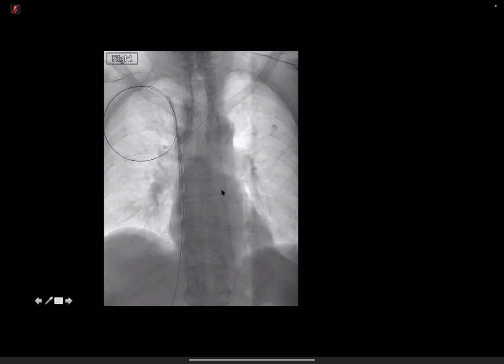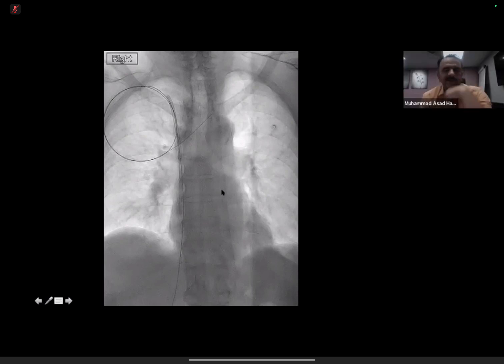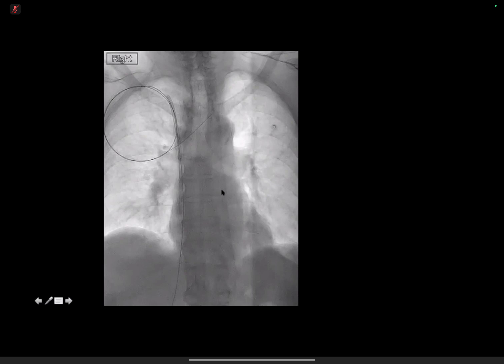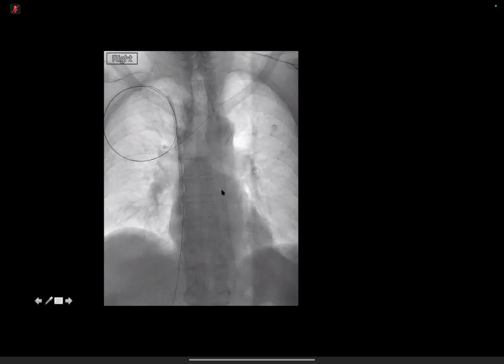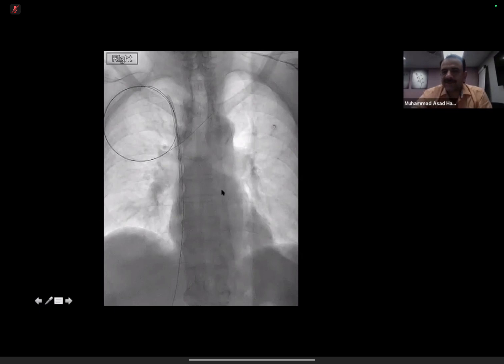There is a tubular. Good. It's a tubular structure passing from the atrium, crossing the SVC and up to the right brachiocephalic vein. I think this is SVC stenting. No. Okay. Maybe. Okay. Now, such cases are fairly common.